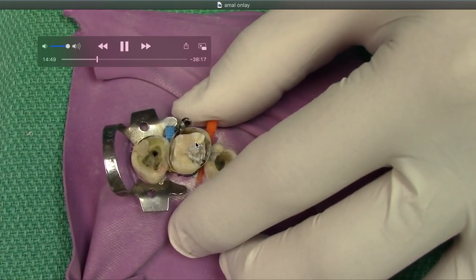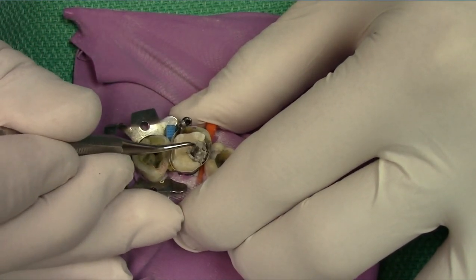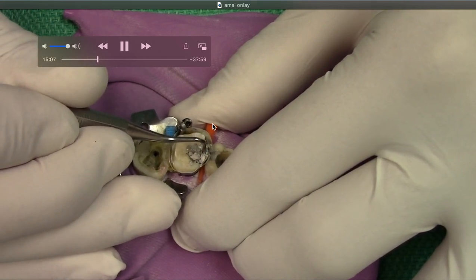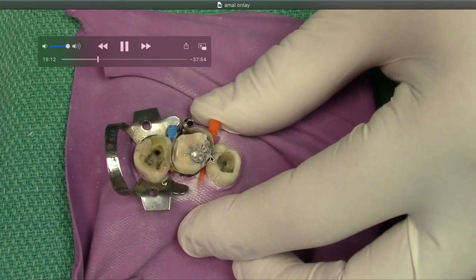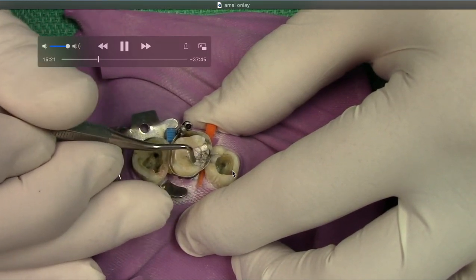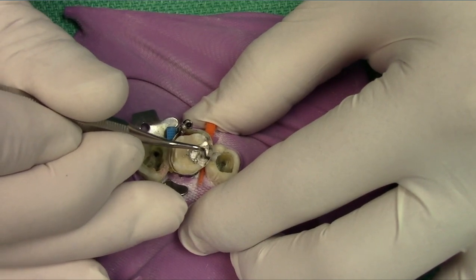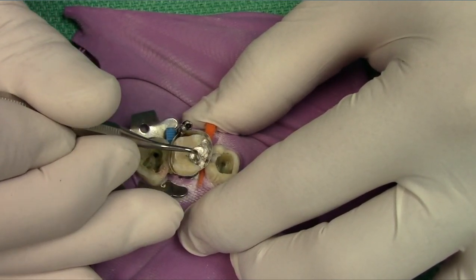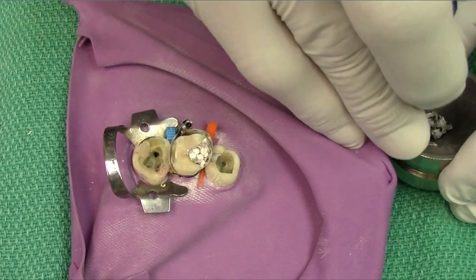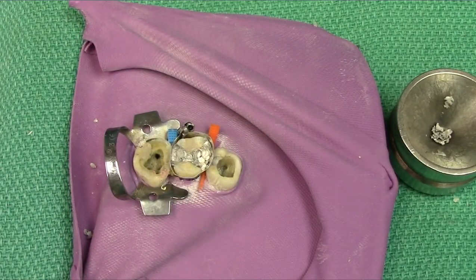A lot of what we do in dentistry is preparation. If you prepare properly and take the time, you actually speed up the procedure. By placing your matrix properly, getting the right reduction, getting the right wedges in, getting the gingival box seal — you can see it's perfectly sealed here. It's just like tiling: if you don't have everything lined up properly, the tiles start going up the wall subtly and causes more work. If you're brand new in dentistry, take the time, learn from the first attempt, and plan for all the what-ifs.